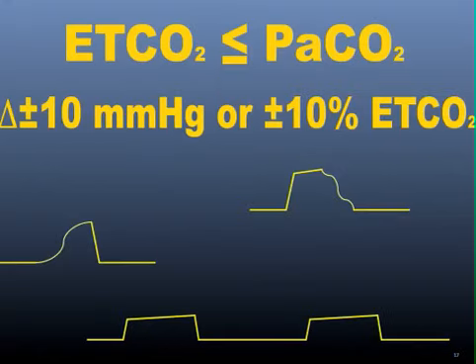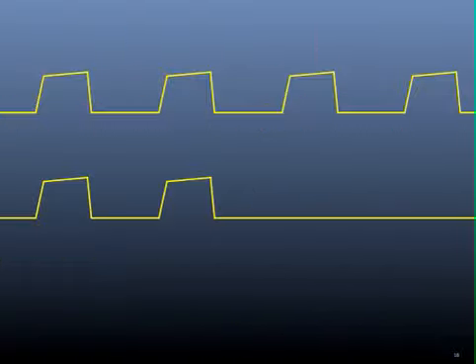Now there are some advanced technical things you can do, such as watch the wave for changes in shape like the shark fin that indicates obstructive lung disease, the fizzle showing an air leak, or hypopneic waves. There's also a debate about whether quantitative changes are useful in predicting upcoming apnea, but don't worry about this complex stuff. The best use is just to answer the simple question that you care about when you're sedating a patient.